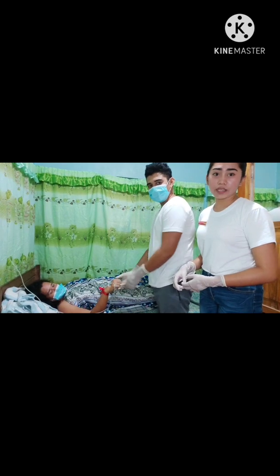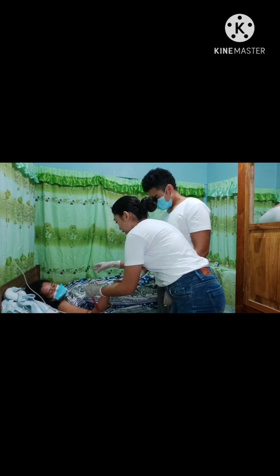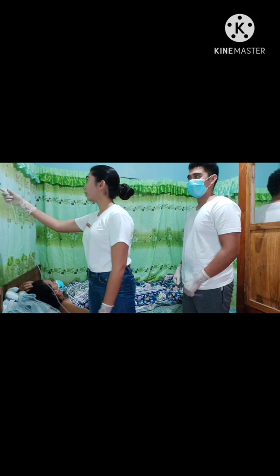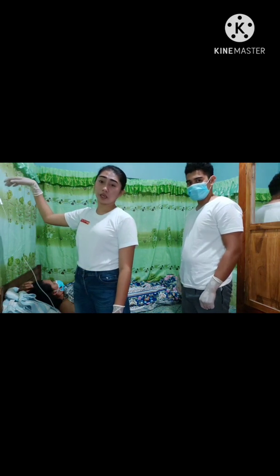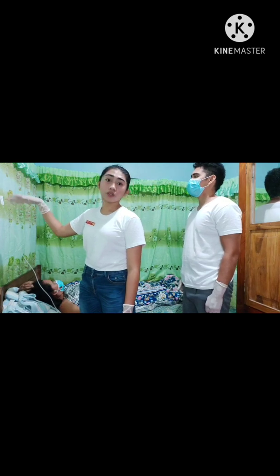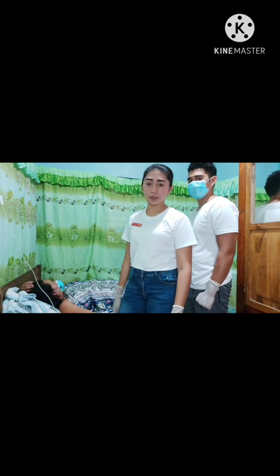So after that, take the tourniquet. Make sure that the regulator is open. And then check that the IV is patent and the flow is dripping, so that we know whether it is already on the side of the vein of the patient.